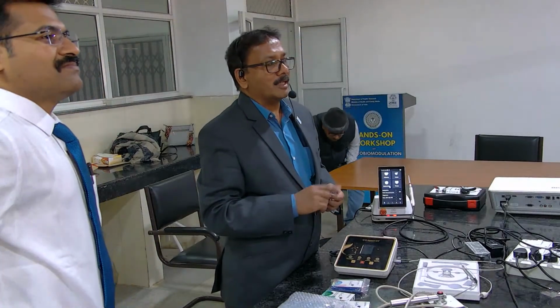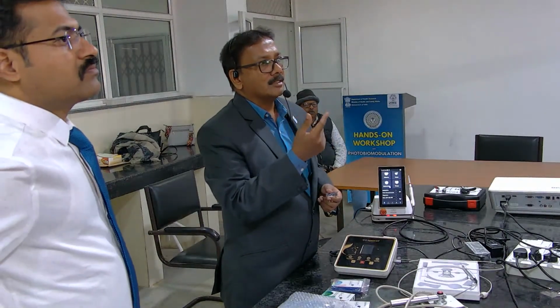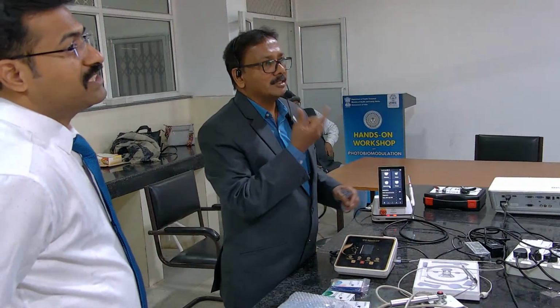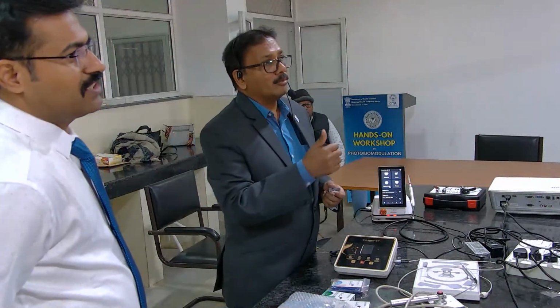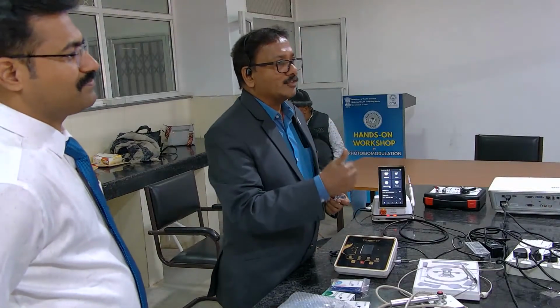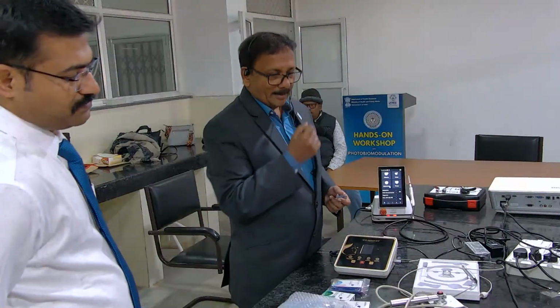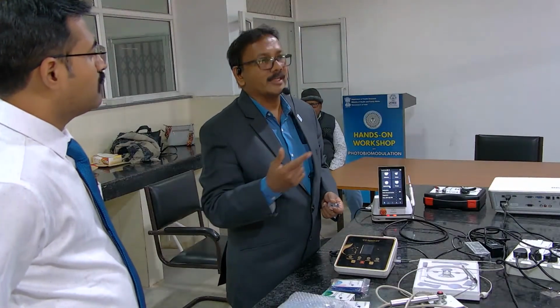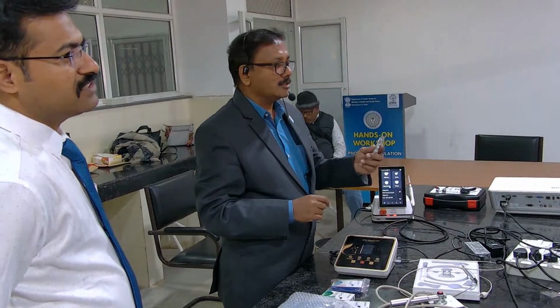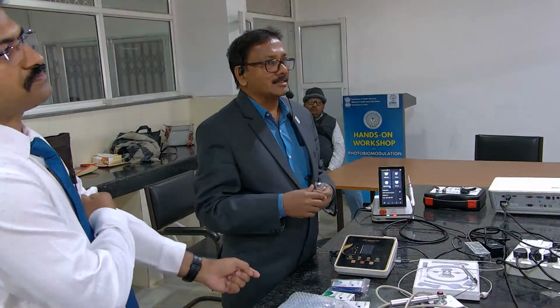Anywhere you can use it, except in pregnant patients and thyroid patients, which are contraindicated. Pregnancy, medically compromised patients, you can use it better also, more also, because where the drugs fail, our lasers come in handy, right? And one more condition where lasers are contraindicated is cancer cells. Those who are having CA, because they claim that photobiomodulation will proliferate the cells.